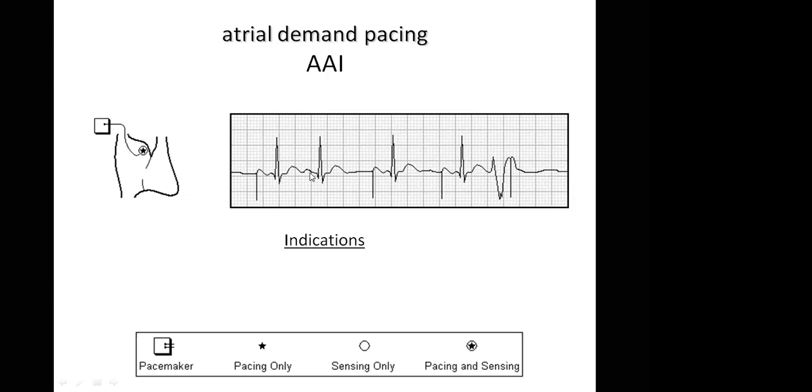By the time it was waiting for the next P wave, the lead was waiting for the next atrial activity. It didn't sense any activity. That's why it had to pace. After that, it also had to wait for intrinsic activity. If it's not sensing it, then it will pace again. Are we following, sir? So after pacing again, it will wait again. Since it did not sense any intrinsic activity, even though a VPC occurred, it does not mean that P wave activity happened. That is why it starts to pace again.